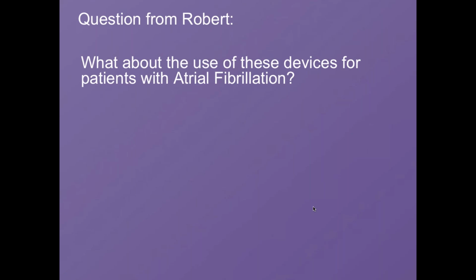So then, if I understand it right, Dr. McCarthy, it almost sounds like a double catheter procedure, one for the valve and also one for the AFib? You would fix the valve with one procedure and then treat the patient for a while, and at a different procedure, they could potentially be candidates for a catheter-based ablation of the atrial fib. Got it. All right, let's keep going.